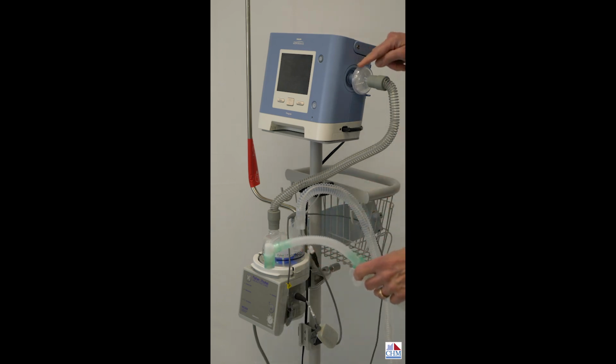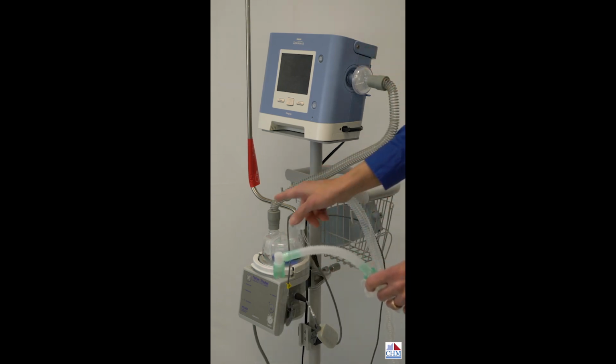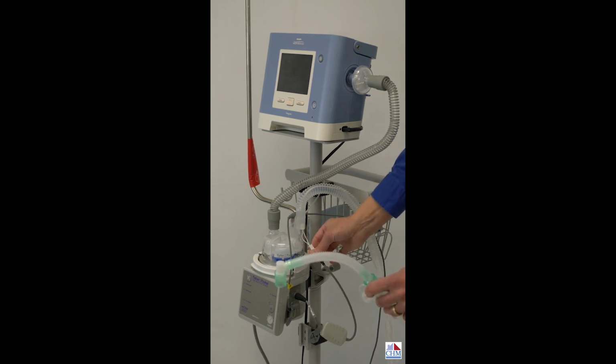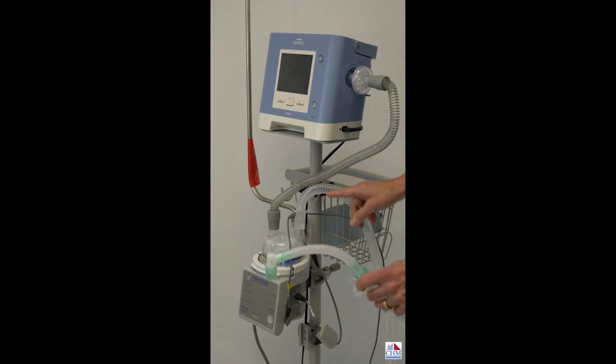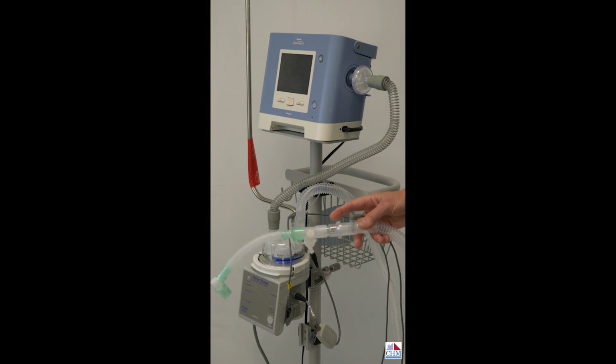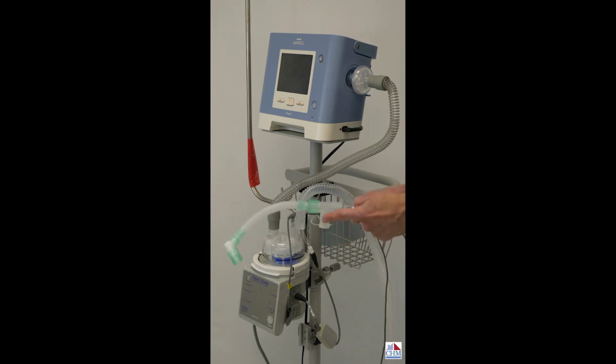Again, the airflow is going all the way through into the humidifier. Temperature is being monitored here. The tube is being heated with this wire, and it travels all the way through, up through the whisper swivel, which remember, that's what makes a passive circuit with the leak. We've got our nebulizer adapter, and then our trach swivel adapter with the flex tube for connection to the patient.